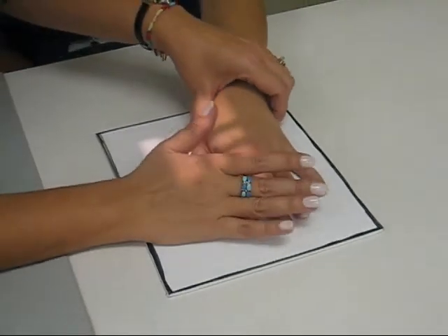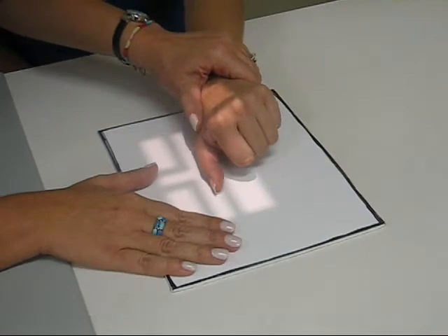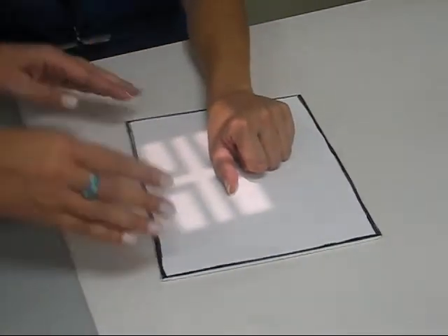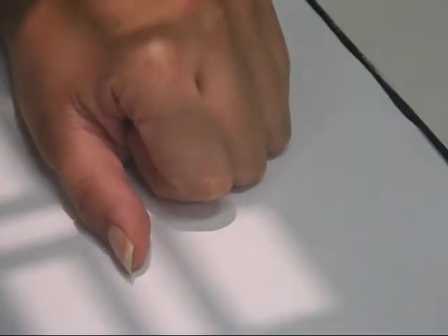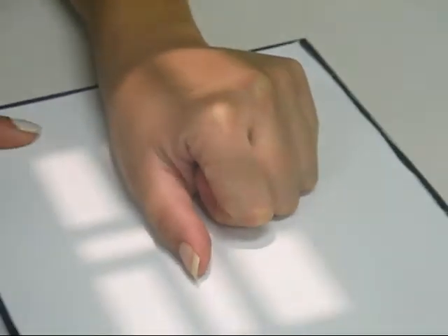For a true lateral position of the thumb, what you're going to do is have your patient close up, fist up their hand, and just bring it like that. Okay, so now your thumb is in a true lateral position.